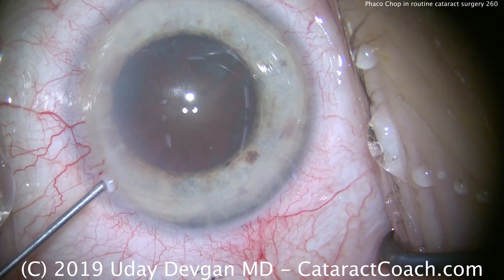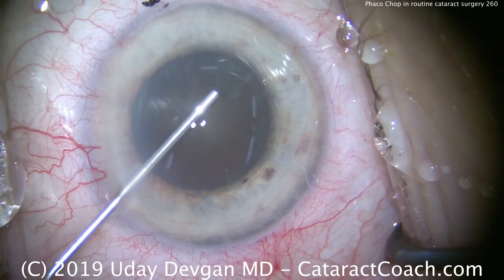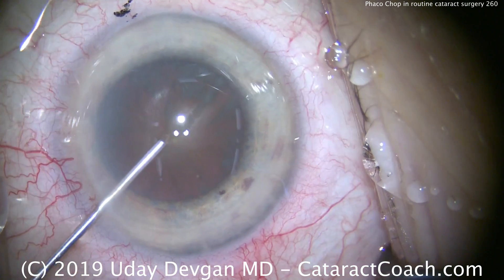We'll now put in our dispersive viscoelastic to form the anterior chamber, but more importantly, to protect the corneal endothelium.